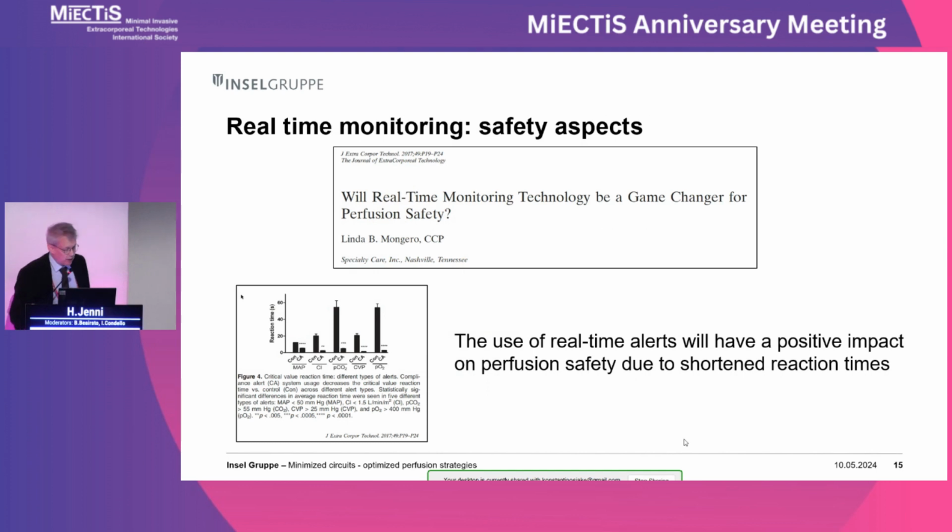And as well, if you have online monitoring, you have to be aware, because when I started, we had manual notes, all the protocols, and now that has changed completely. Now everything is automated. Put alerts in, because that really increased the overall safety as well, as pilots do, you know. Every parameter has to have an alert.